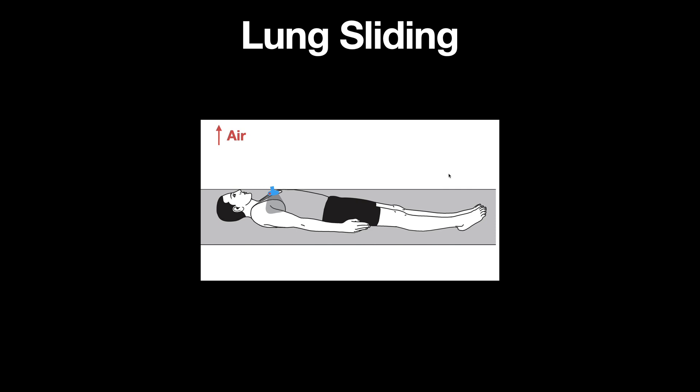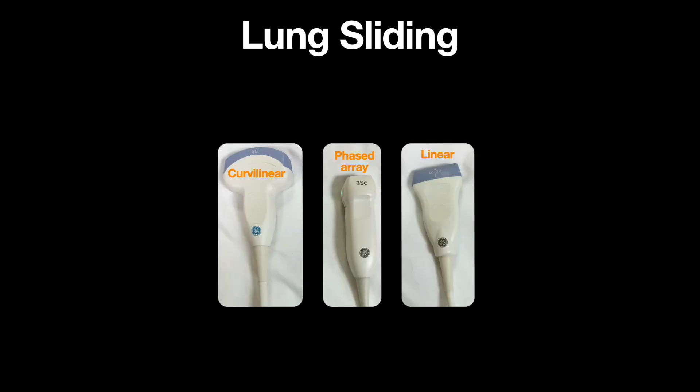It's important to note that lung sliding can also be seen with a phased array and curvilinear probe. However, it's usually easiest to visualize with a linear probe given its superficial nature.